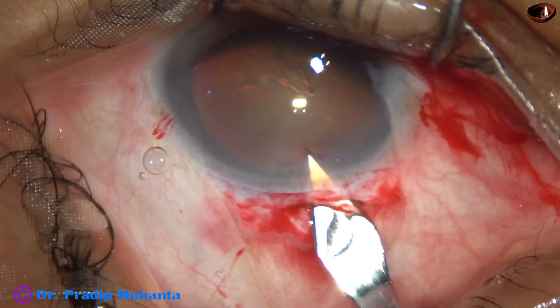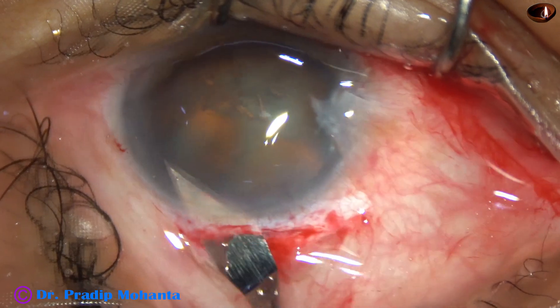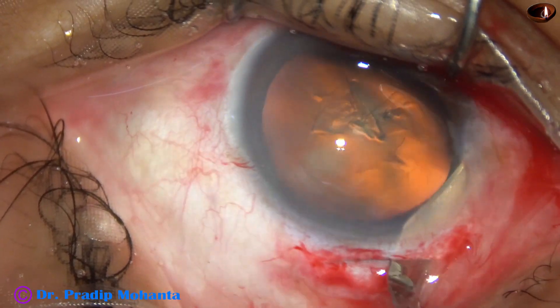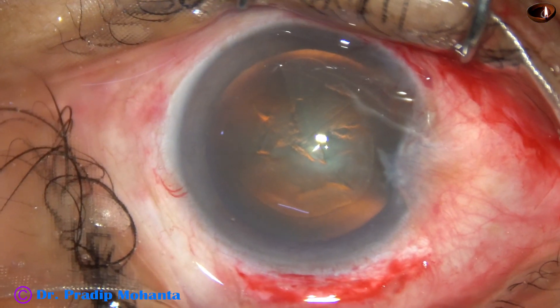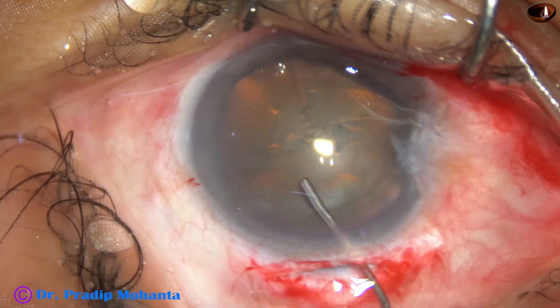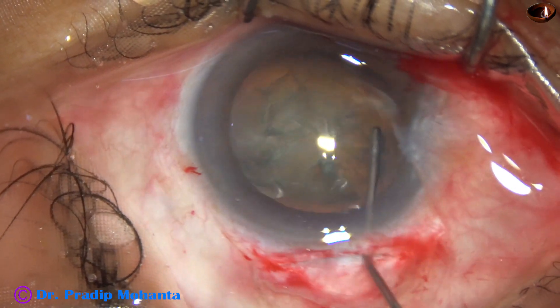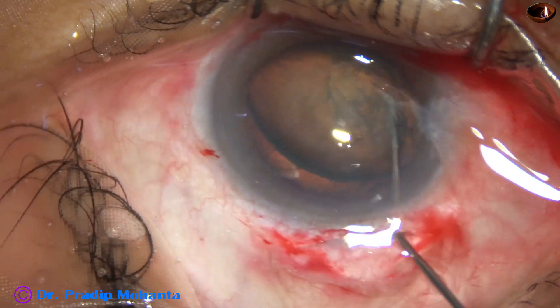And now the tunnel is opened. We must go to the anterior extreme of the tunnel and then enter into the anterior chamber. Now hydrodissection is done. I didn't want to prolapse the nucleus because I want to divide the nucleus in the back.